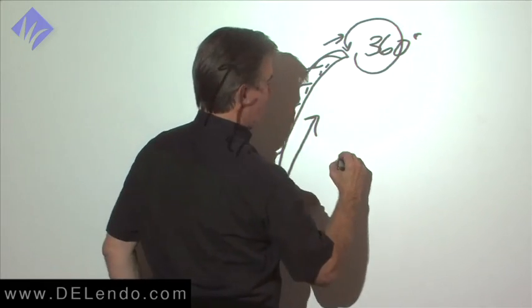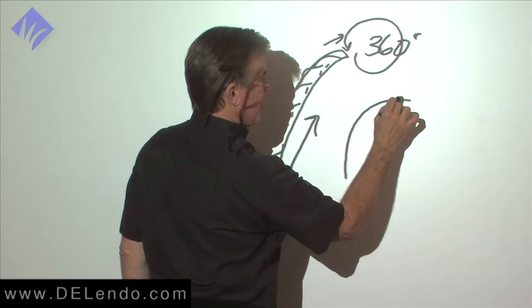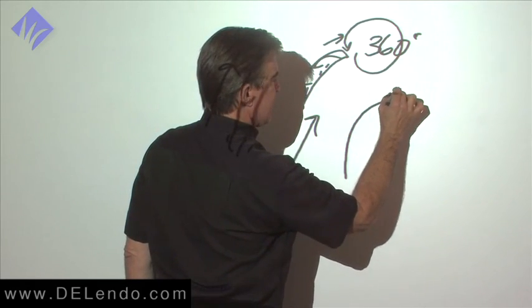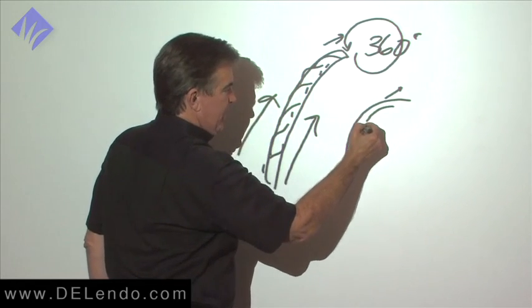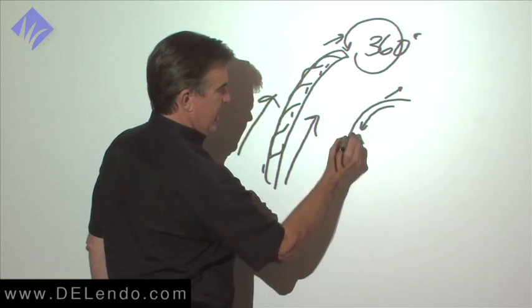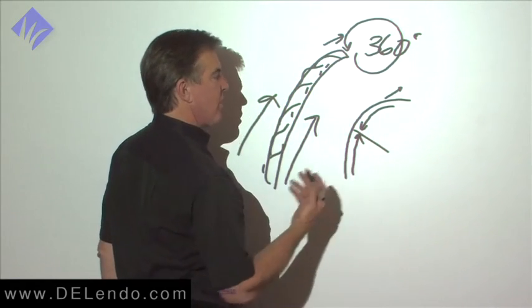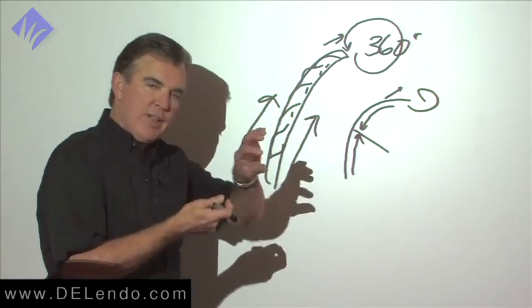Okay, so if the blades are around a curve in a quarter turn pull, the blade wants to go like this. In a counterclockwise rotation, the blade wants to exit the canal. We're holding it in there so it can't, okay? It's not moving coronally or apically, so eventually this tip will make the cut and you'll feel it give.